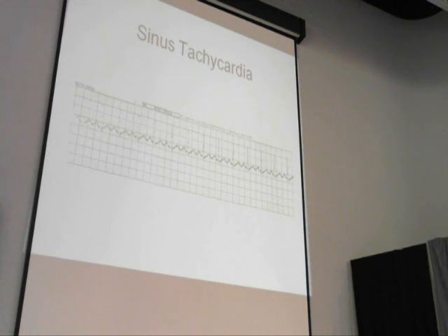Okay, now sinus tachycardia. Sinus tells us all the pieces are there. It fits the whole definition of sinus rhythm with the exception of rate, if it's too fast. And on Thursday, when we get to ACLS, we're going to talk about stable and unstable tachycardia, wide complex, narrow complex, medium, high rate, and low rate. We're going to get really freaky on Thursday. We're just kind of reviewing sinus tachycardia.